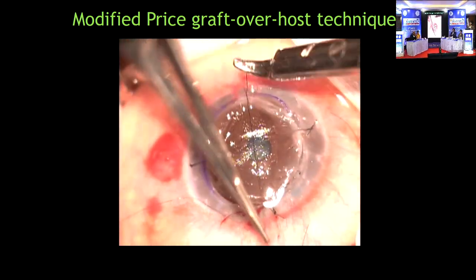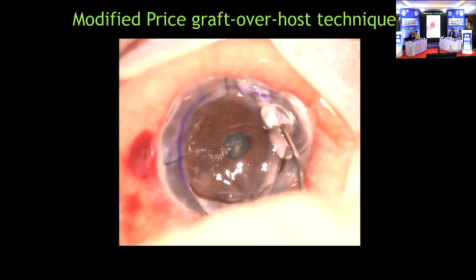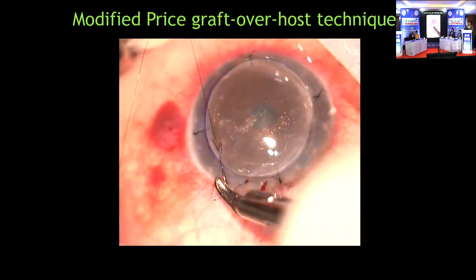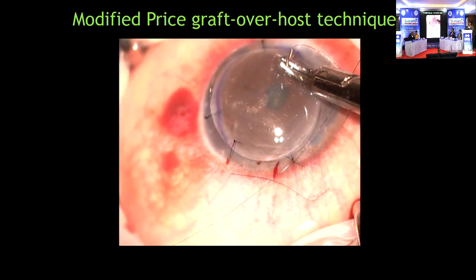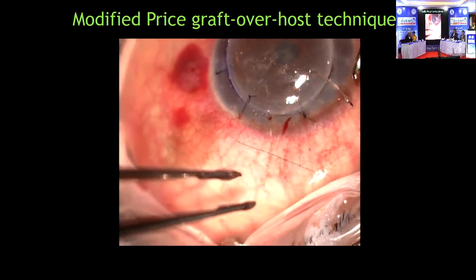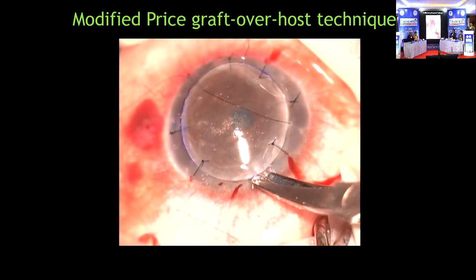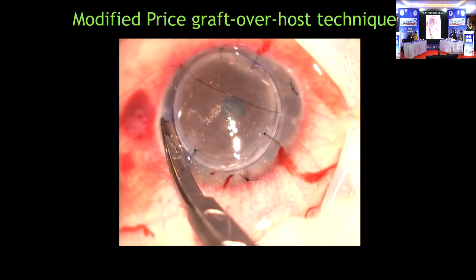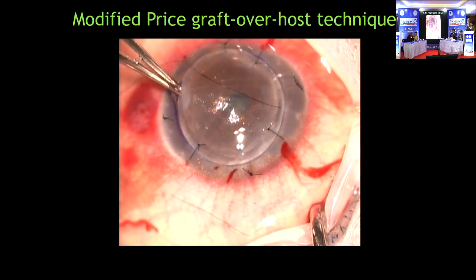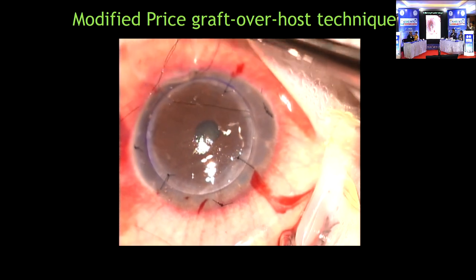over it, and then we'll put the graft over it, and then after applying the cardinal sutures, like here I am applying the visco, and then sutures are applied over the graft to the host, and then we'll cut the remaining sutures. So the 4 sutures are there to secure it, and after this the prior sutures we applied will be cut, and then the posterior stroma tissue is removed from there, and then the routine keratoplasty is completed.